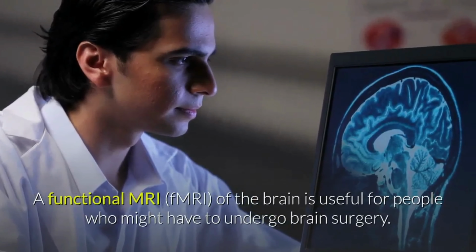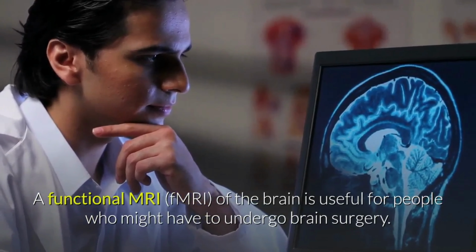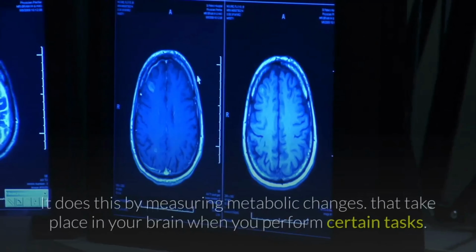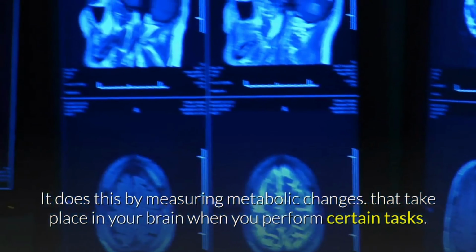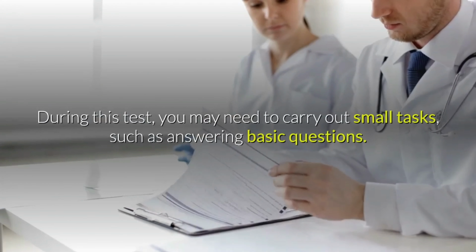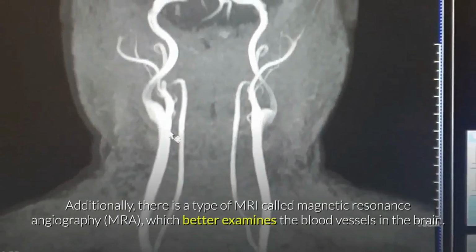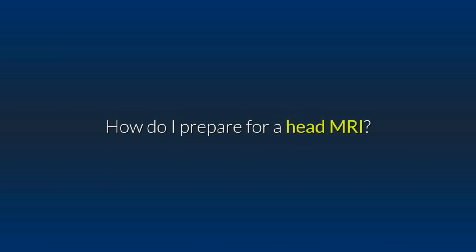A functional MRI (fMRI) of the brain is useful for people who might have to undergo brain surgery. An MRI can pinpoint areas of the brain responsible for speech and language, and body movement. It does this by measuring metabolic changes that take place in your brain when you perform certain tasks. During this test, you may need to carry out small tasks, such as answering basic questions. Additionally, there is a type of MRI called magnetic resonance angiography (MRA), which better examines the blood vessels in the brain.